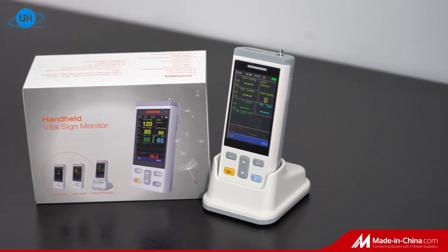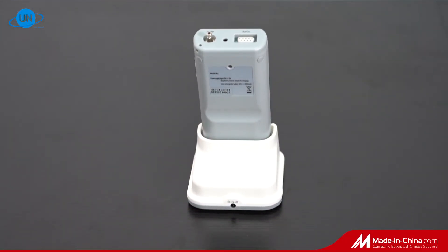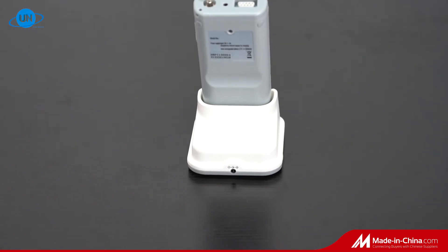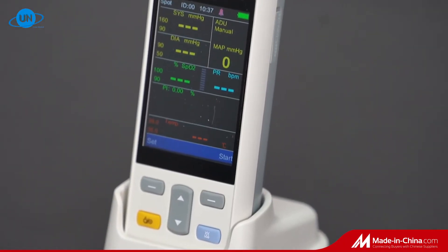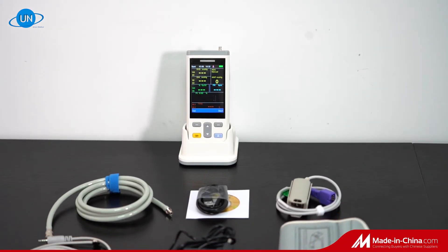It can be used on adult, pediatric, and neonate patients, with multiple parameters available as options: NIBP, SpO2, Pulse Rate, Perfusion Index, Temp, and Mainstream or Sidestream ET-CO2.